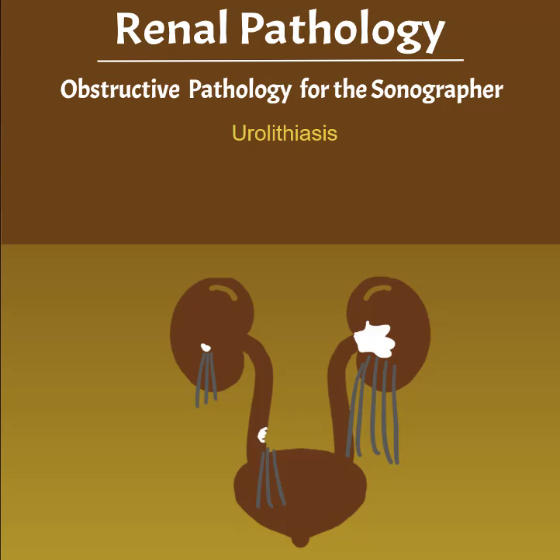Welcome to our sonography lecture on renal pathology, part 12 of 14, obstructive pathology for the sonographer. This lecture will cover urolithiasis.